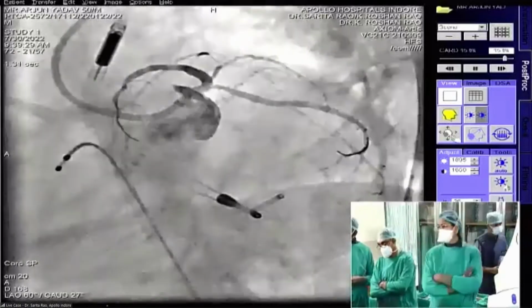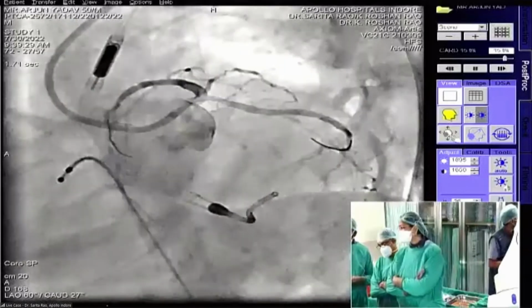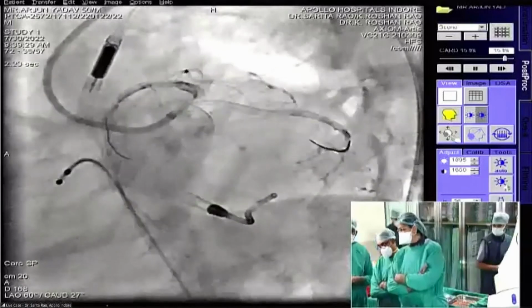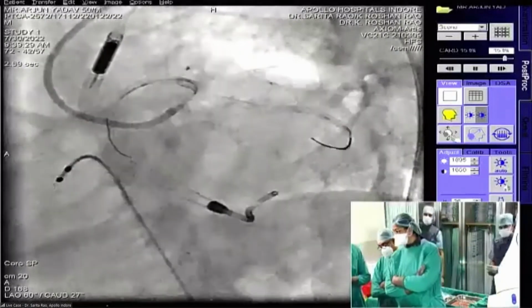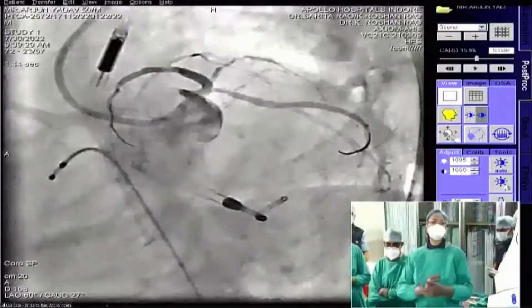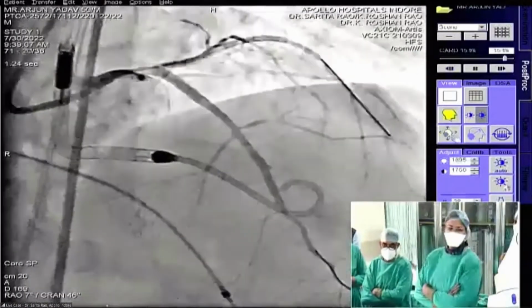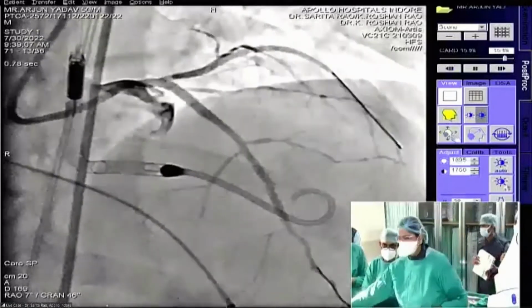Raj, can you tell me how much the left main diameter was measured on OCT? On the OCT, it's 7.9. Okay. Diameter, I think it will probably take a slightly bigger balloon because it looks a little less. And as we covered up to the ostium, there's no worry of proximal dissection. You can be a little liberal and optimally size with a stent. Some people believe in stenting only from the diseased area. There you have the worry that it would get dissected in the proximal portion.